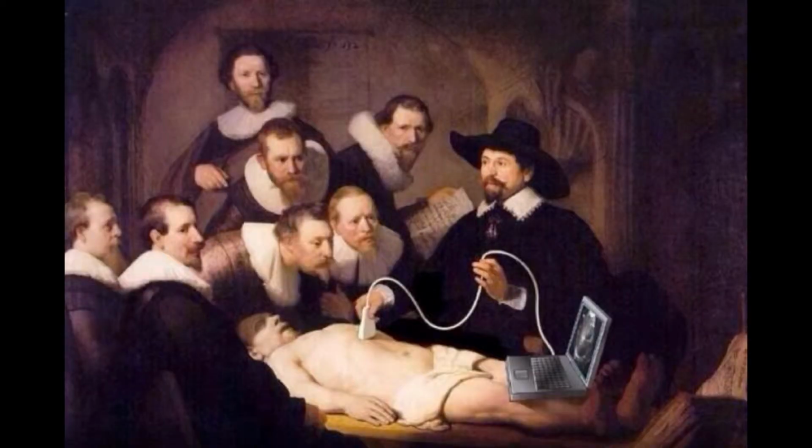Before we go into this topic in any great detail, first I want to review a bit of history. You see, the FAST scan has been around for a very long time. It was introduced way back in the 1970s as a screening test to identify not readily apparent injuries in our trauma patients with altered consciousness, intoxication, or other painful distracting injuries.